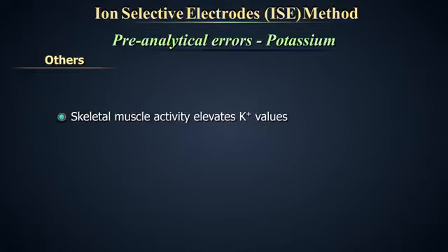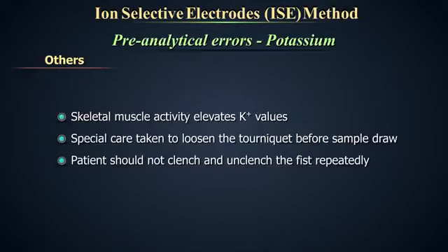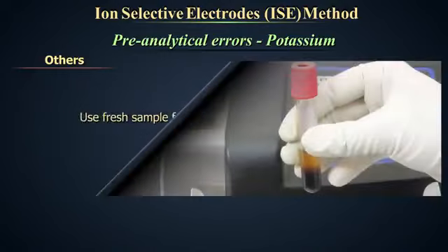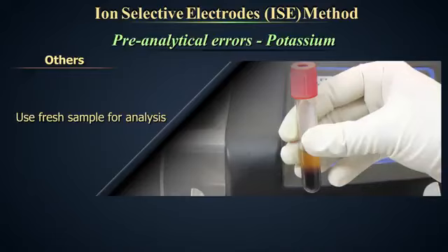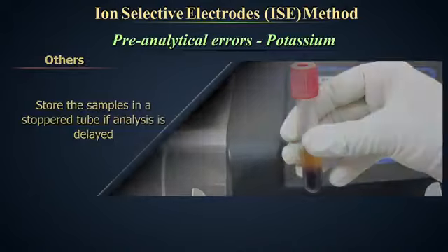Skeletal muscle activity causes potassium efflux, elevating potassium values. Special care should be taken to loosen the tourniquet before sample draw. Patient should not clench and unclench the fist repeatedly. Use fresh sample for analysis when possible. Store the samples in a stoppered tube if analysis is delayed, as evaporation from serum can lead to erroneous results.